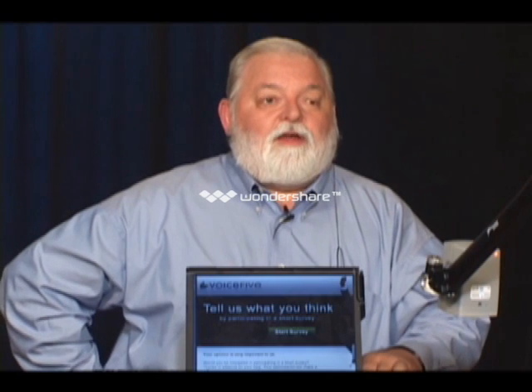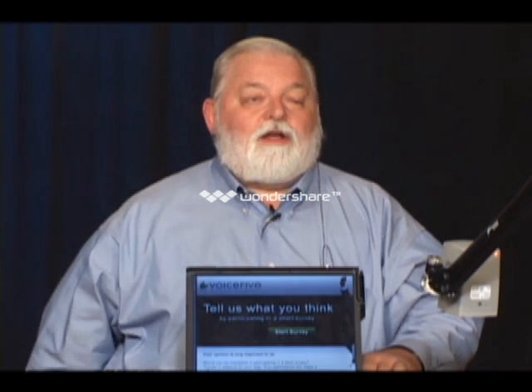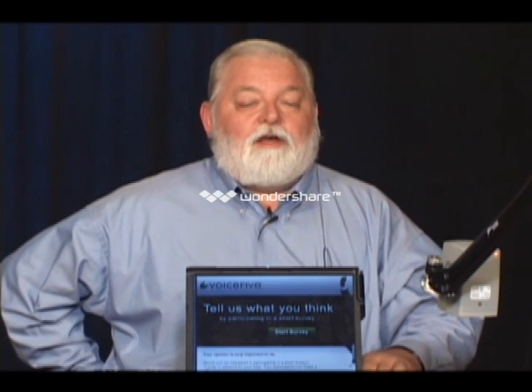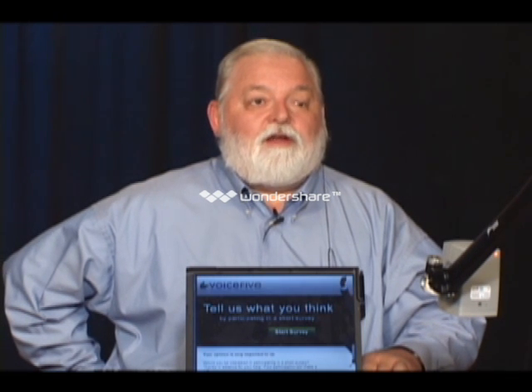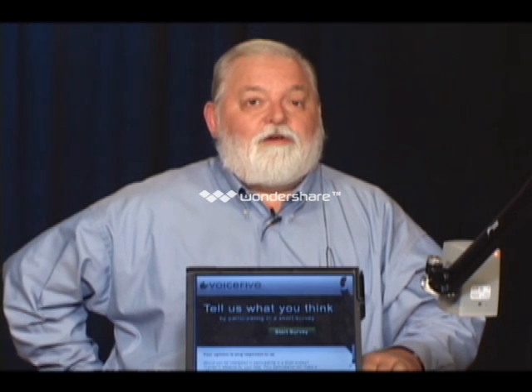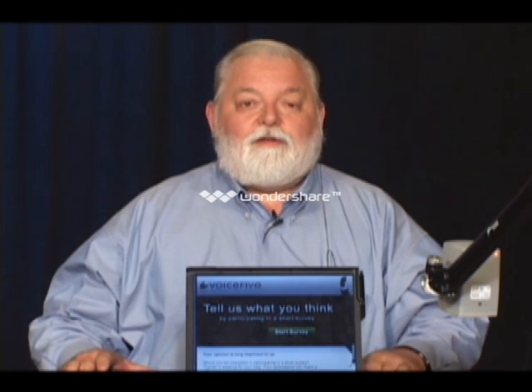But that's really the only thing that Magic and JAWS together do, is help to bring those two environments together so that you can see exactly where I think I am on the screen, or where JAWS is and where Magic is, and you can help me then find the place I need to get. I don't know if that's clear enough or not, but I'm not quite sure if that's the answer you're looking for. The person that asked the question said that your answer does clarify what he was looking for. Okay, I hope so. We do have one more question on the chat.